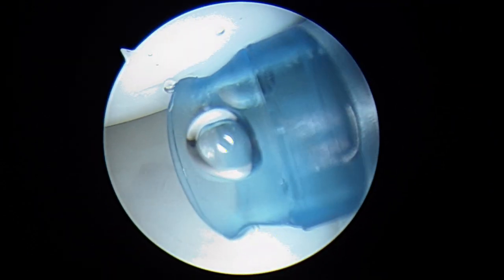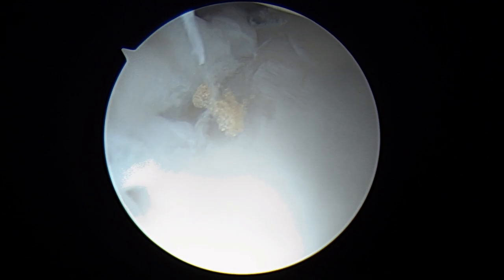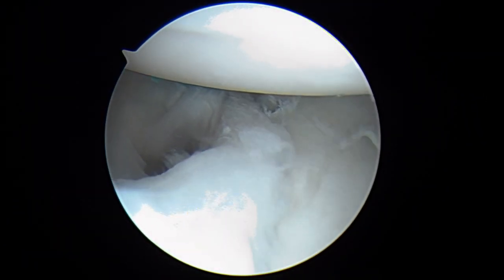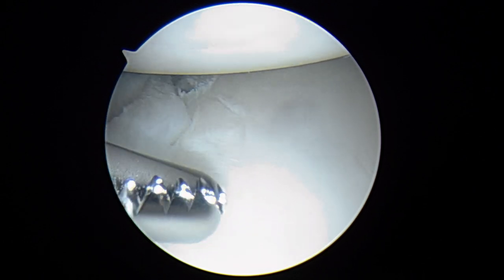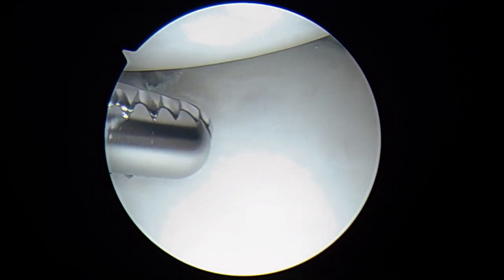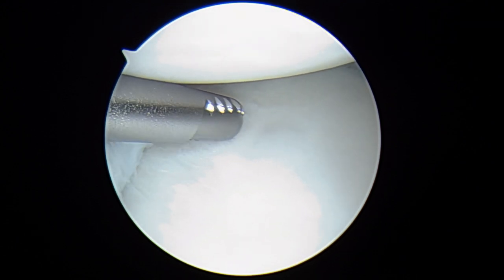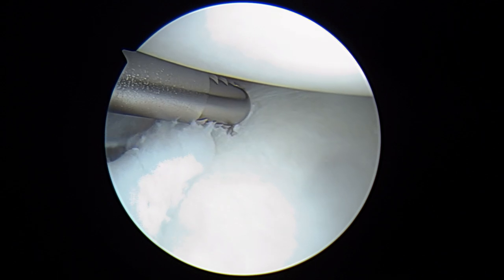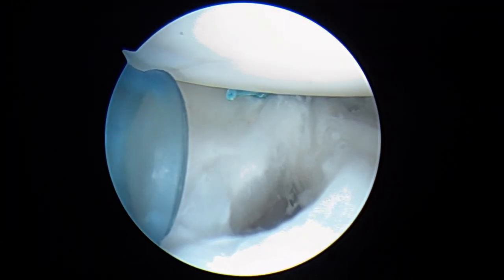We've got our mattress stitch tied in the front and a balanced mattress stitch tied in the back. I don't think I really want to do anything else — we'll put in the shaver just to make sure there's no other debris or loose pieces of cartilage floating around, but things look pretty good. I'm optimistic that that'll do the trick for you. These surgeries are all about doing a balanced repair, and I don't think we have to do more than what we've done here. That looks stable — that's right where our anchor is, that looks good. We're going to finish up and get you back to the recovery room shortly. Good luck to you now.